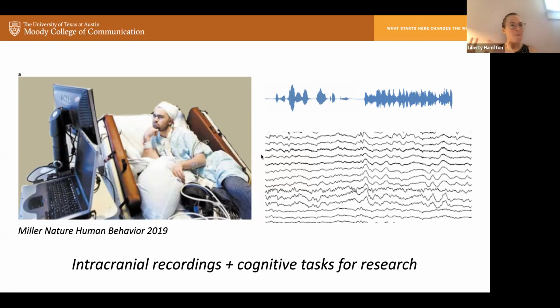And so I think people are making efforts to standardize. And BIDS, which I think you've already heard about, is one way of thinking about that. There are also other formats that people have proposed, but I would say iEEG is still much worse and earlier than the other neural recording methods. I think fMRI is probably the most standardized in terms of what I've seen from other groups. So before I go on, any questions about any of this setup or the context in which we're doing this?